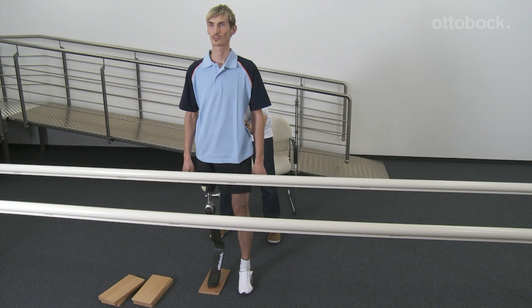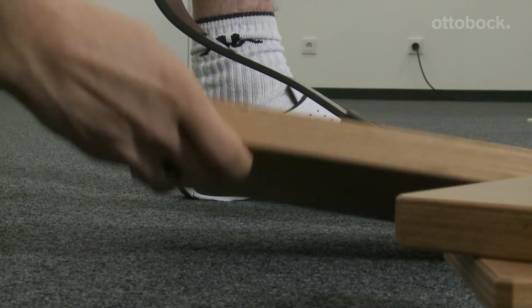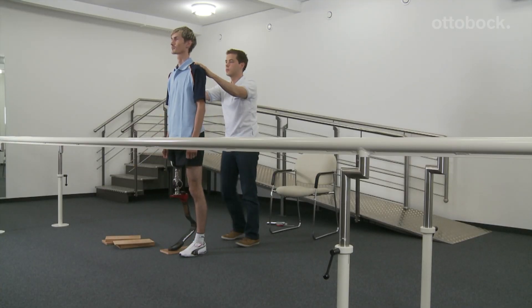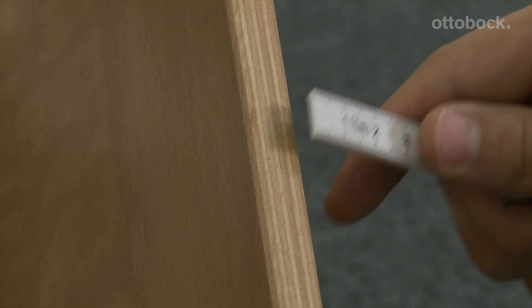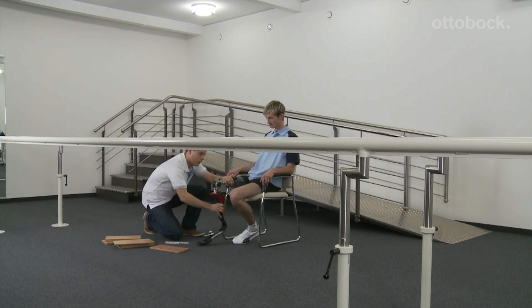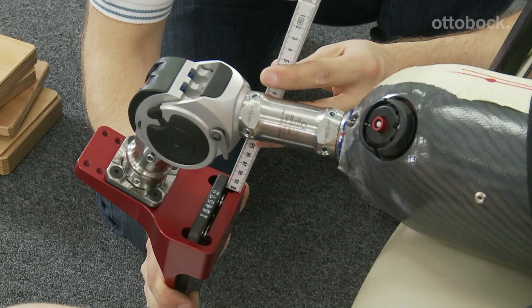The goal of the prosthesis length check is to determine the physiological leg length, whereby the prosthesis can be up to 3 cm longer than the contralateral leg in order to compensate for the spring deflection in the stance phase and minimize the risk of stumbling. The leg length difference determined with the distance boards is readjusted with the test adapter. The user sits on a chair, the screws of the spring are loosened and opened completely. The spring is then shifted by the difference determined and retightened with 15 newton meters.